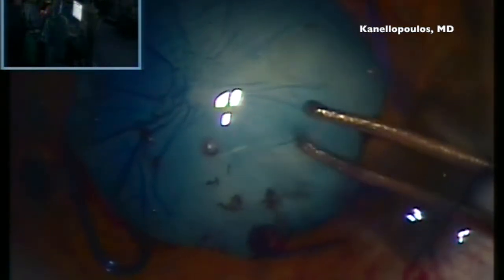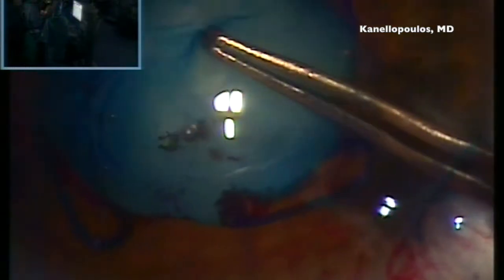We're all appreciating the facility that the Malyugin ring is offering us through these manipulations. So eventually, when nothing else works, we're going to incise the anterior capsule with the keratome. So now the keratome is a capsulotome, since we're incising the anterior capsule with the keratome blade, and thus creating an edge, which now I can grasp with my Utrata forceps and try to create a continuous capsulorhexis.